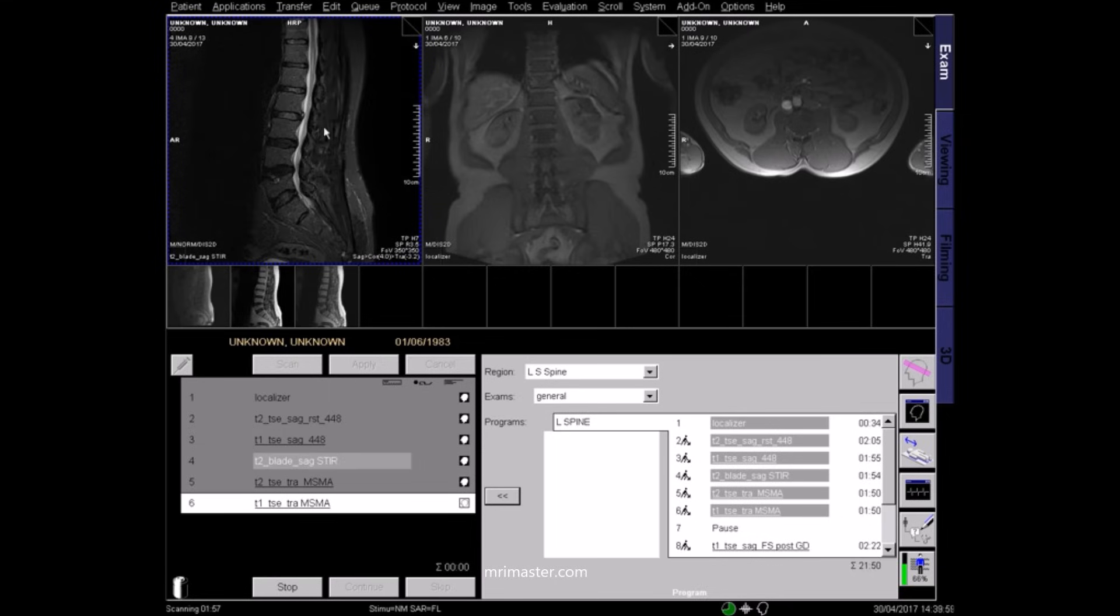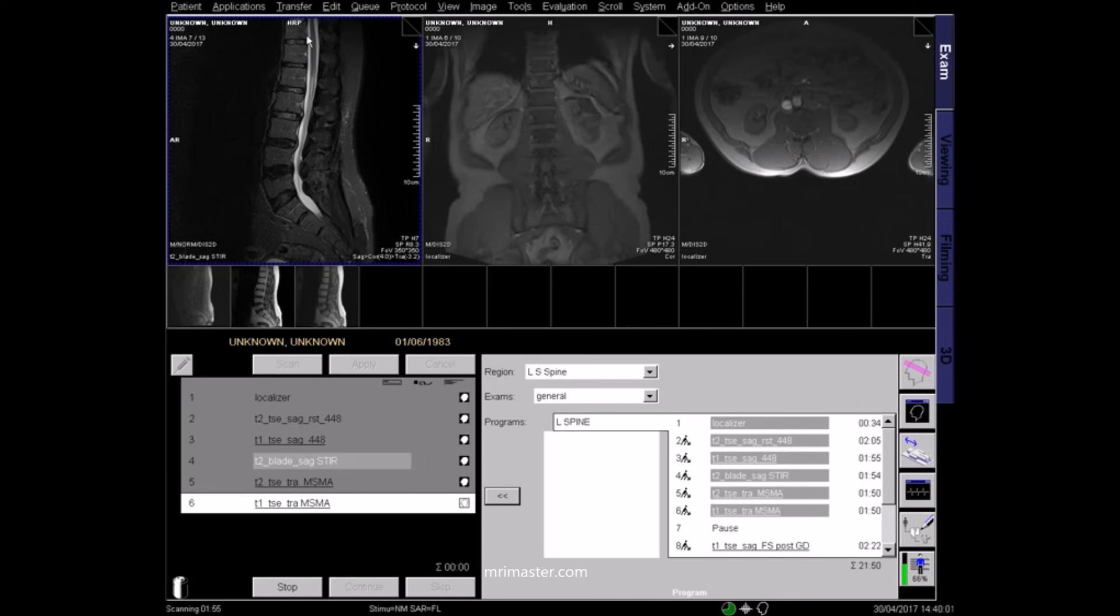This is a STIR or short tau inversion recovery sequence. Here, fluids appear bright and fat appears dark. STIR images are very useful for the diagnosis of infections, fractures, and bony metastases.